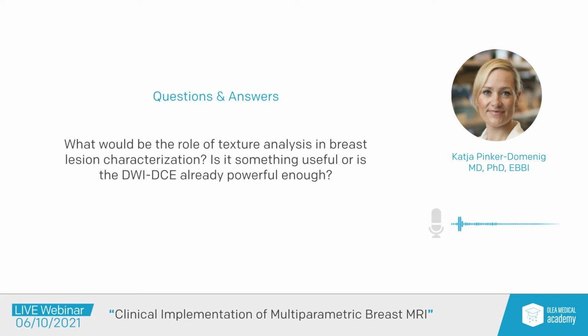The results are encouraging. The problem to date, and that is why this is currently not used in clinical practice, is that we don't have a plug-and-play solution. If you had a platform where you just click your lesion, like the Olea platform or other platforms have now, where you see your enhancing scan, go on your color map, click the lesion, and it analyzes the functional tumor volume and gives you this is washout, this is plateau.